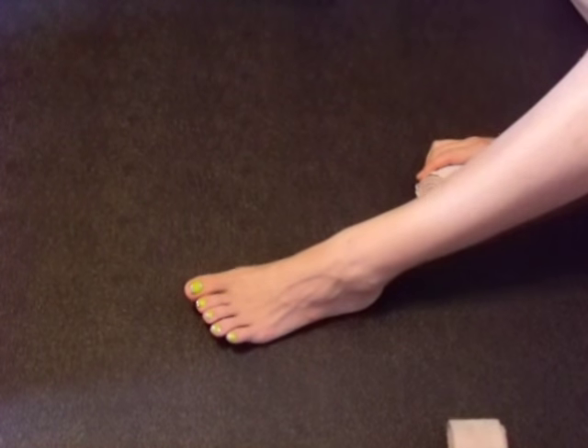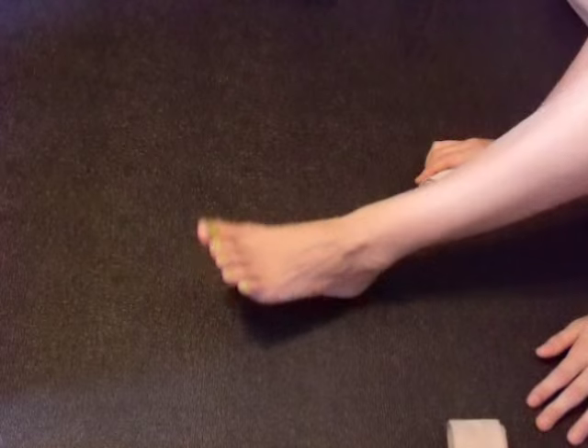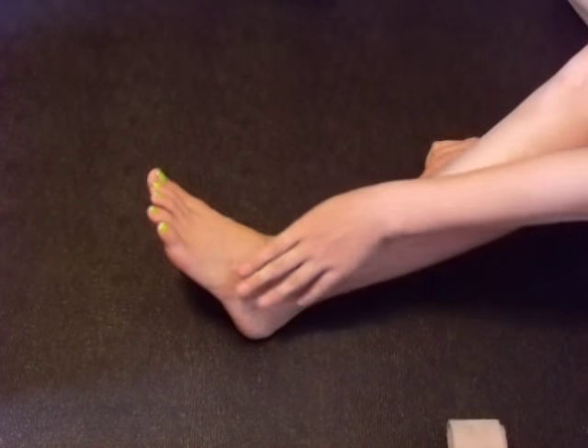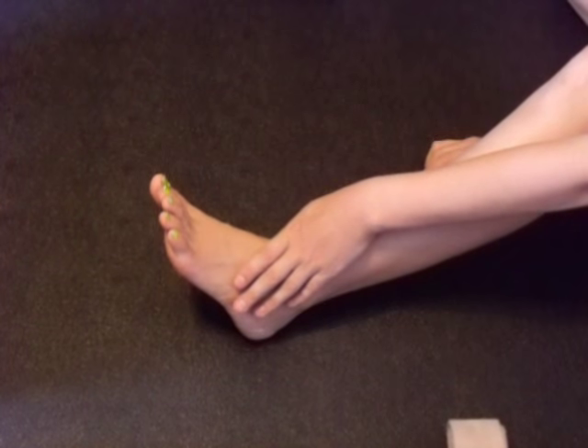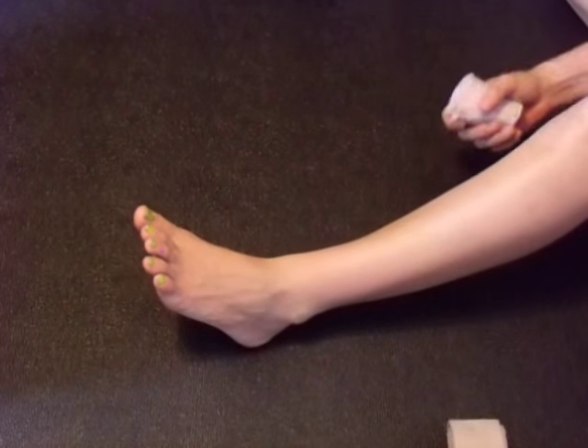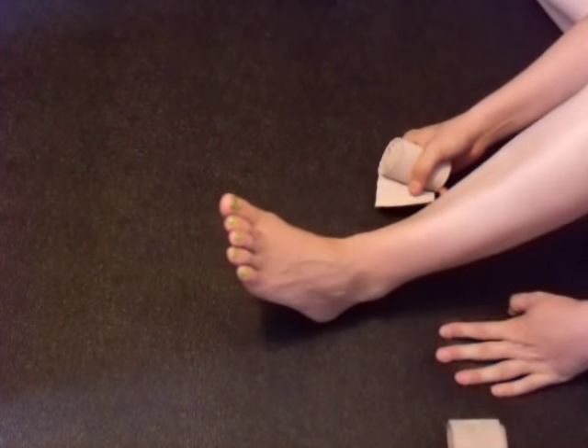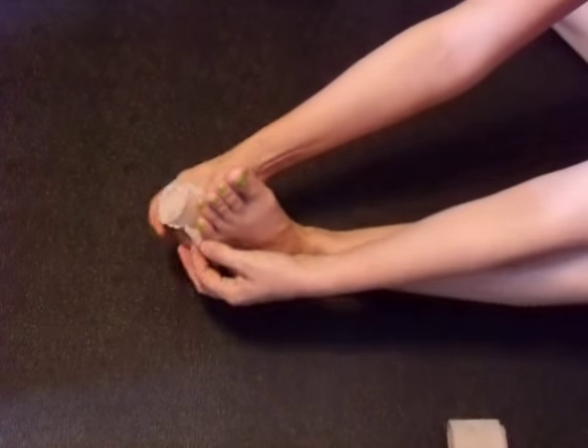This brace that you're going to build is going to keep your foot at an L-shape, like you're standing up. You'll be able to slightly move it up, but you won't be able to move it back down. You will be able to put on even a tennis shoe, but you'll have to loosen up your laces — you're not going to be able to put it on real tight.